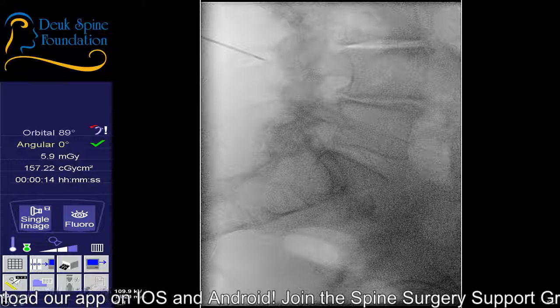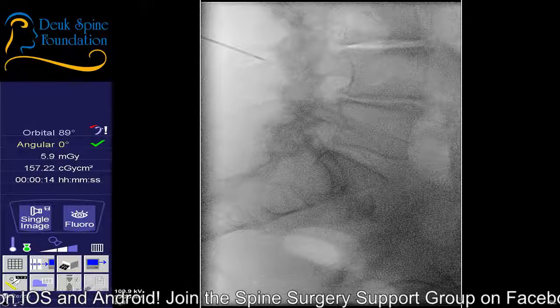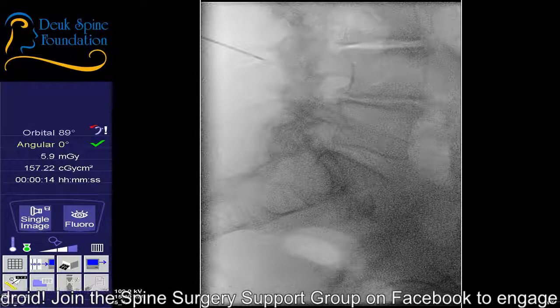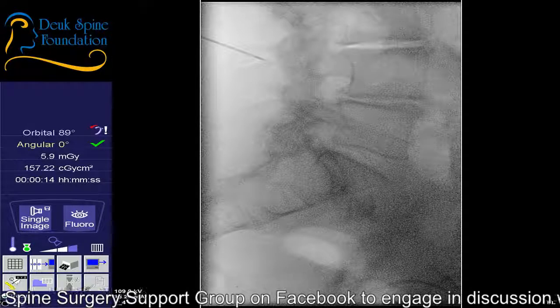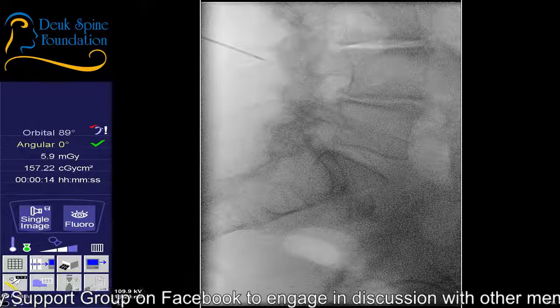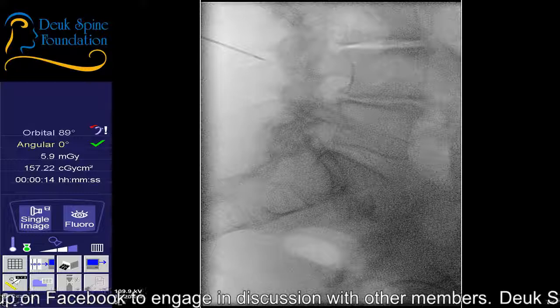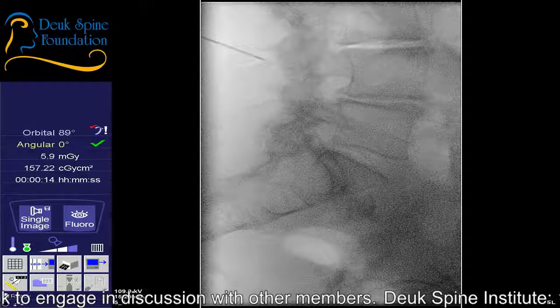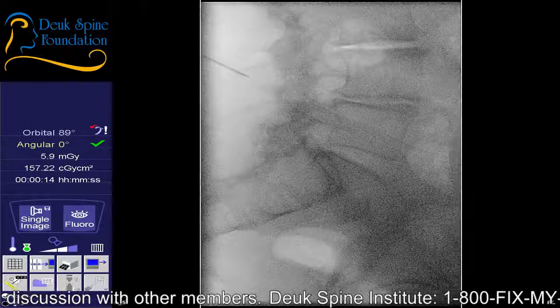But again, why are we seeing so much below the sacrum? We shouldn't be seeing all that soft tissue. Right? It's very odd that we're seeing so much soft tissue. So what we're dealing with is the scoliosis, folks. And because her spine is curved, it's creating a challenge, not with respect to the surgery, but with respect to getting the x-ray in the proper position.